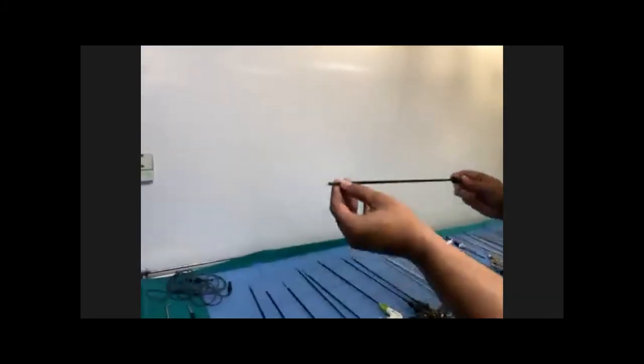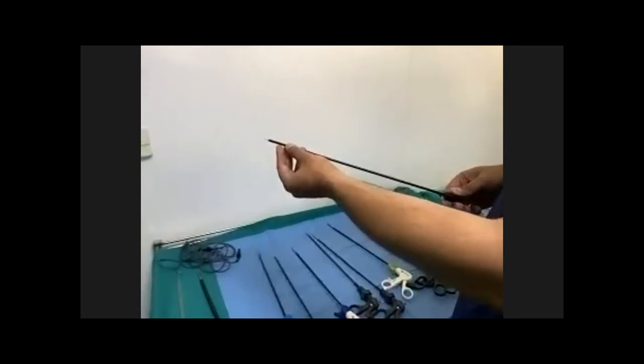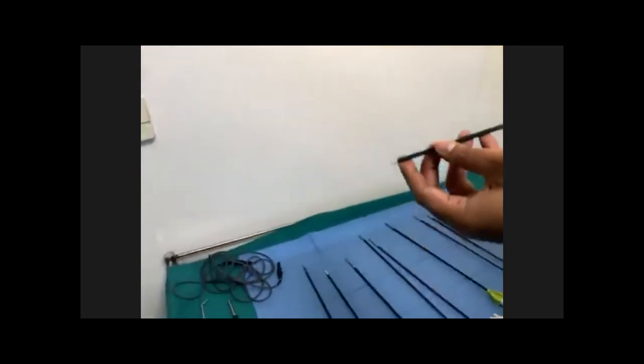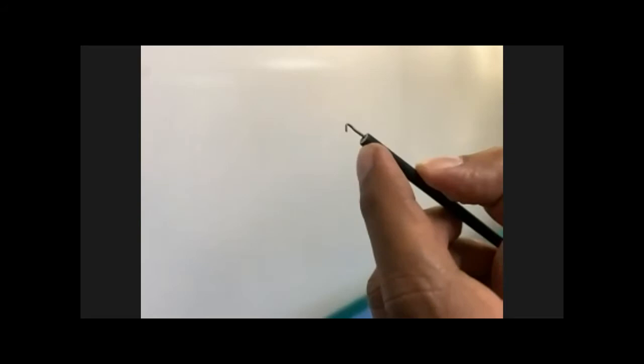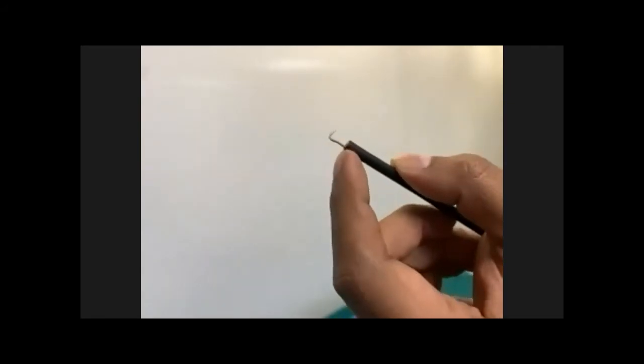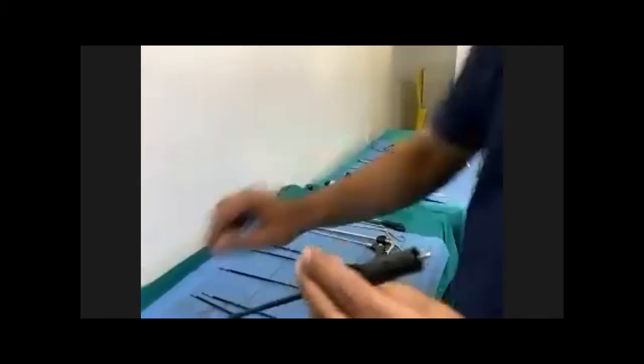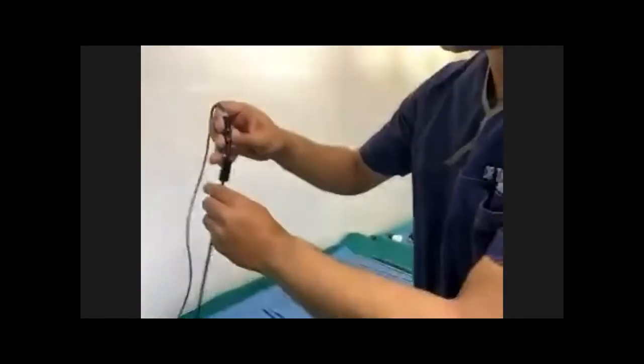Now, this is another important instrument, which is called the L-hook. Okay, you see there is a tip, an L-type tip over it. You can use it for cautery, and it has an end over here where you can attach the lead of the cautery.